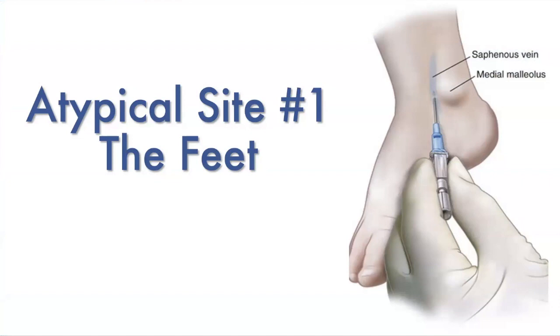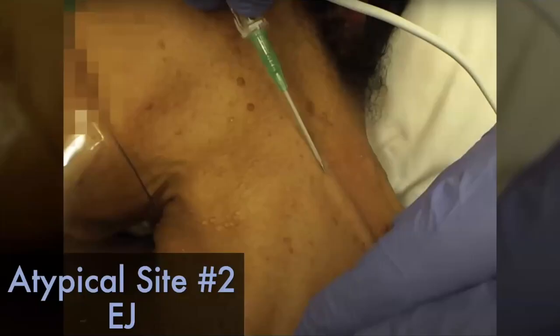down at the ankles. And then if that's not there, another place that people love to go is the external jugular vein. This is a great line if you can get it. Can be kind of tricky sometimes.